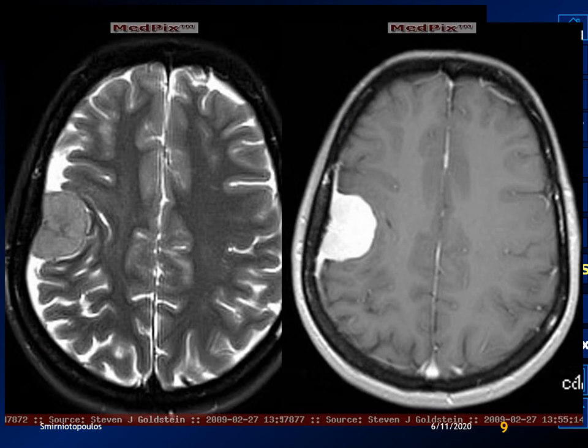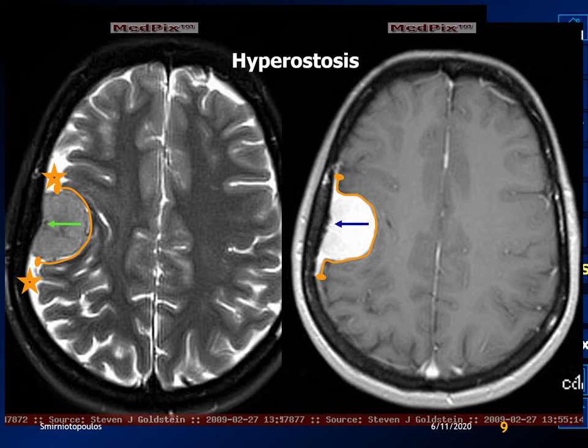Here's a typical example of a meningioma. We see the classic hemispheric shape, broad-based against the dural surface, widening the subarachnoid space at the margins. We can see homogeneous enhancement, a dural tail at the edge of the lesion, and we can also recognize that there is hyperostosis.